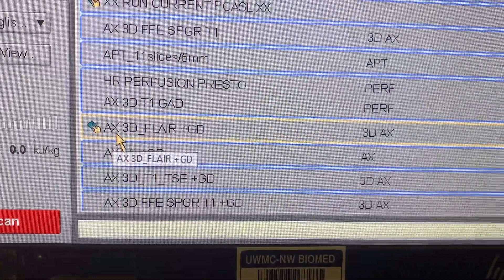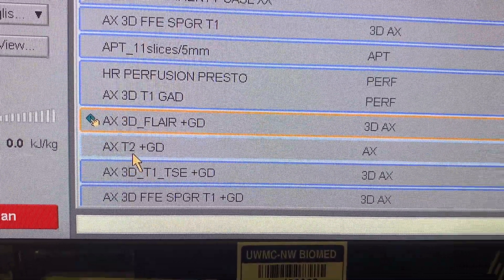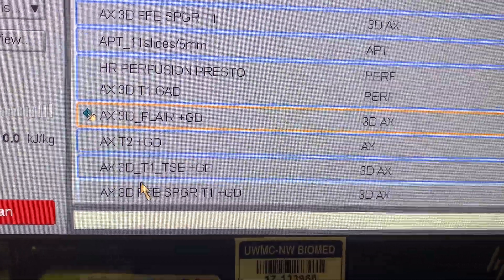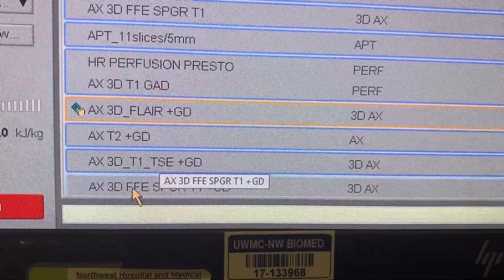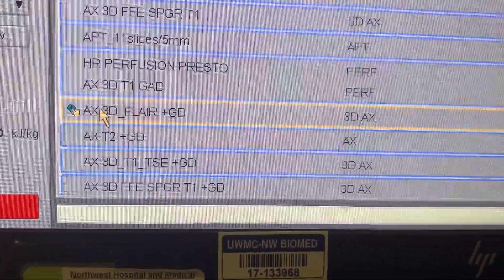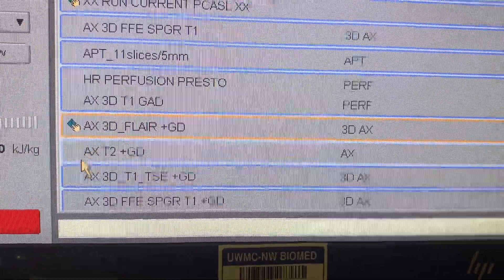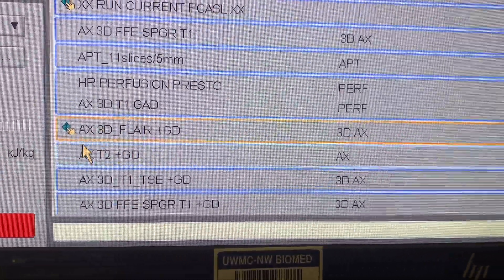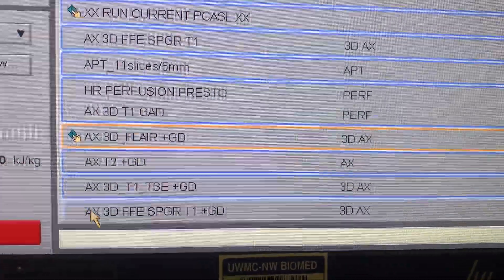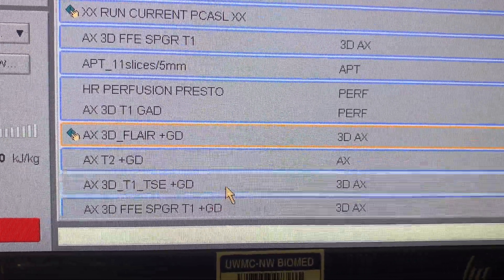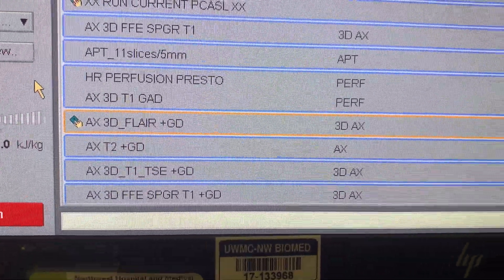The remaining post-gadolinium sequences — 3D FLAIR, T2, T1 fat sat, and T1 regular 3D post — are all routine sequences. We're not going to focus on coverage; it's normal entire-brain coverage on all of them.